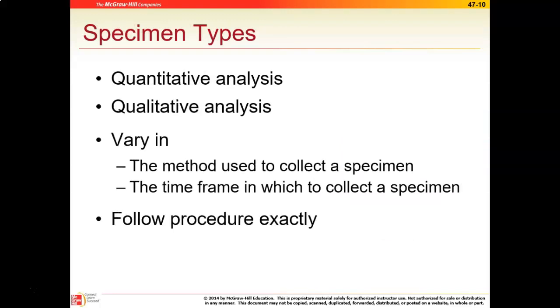Okay, so here's two words that we've seen before, quantitative and qualitative. We're going to talk about this a few times as we go through the next couple of weeks. Remember, quantitative is looking at how much of a specific analysis. Qualitative is generally looking for the quality or just the presence. So a lot of times a qualitative analysis is either a positive or a negative, or a yes, it's there, or a no, it's not, okay? Quantity refers to if it's there, how much is there, okay?